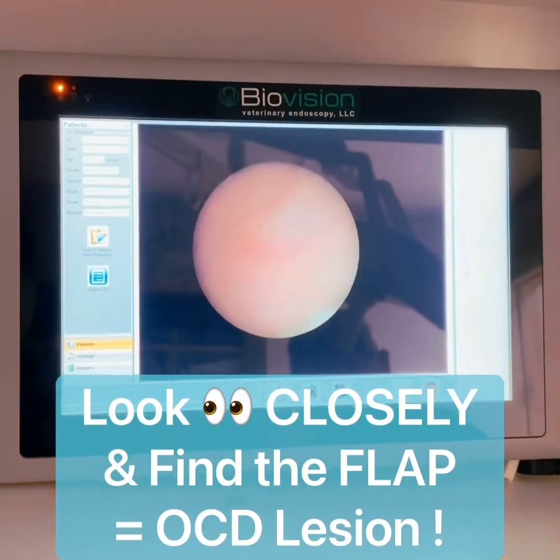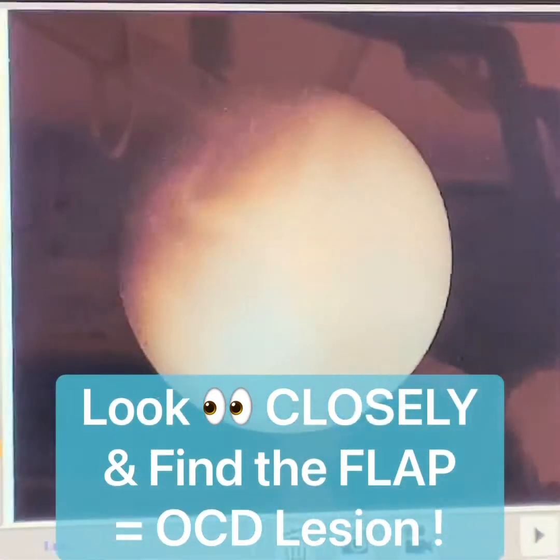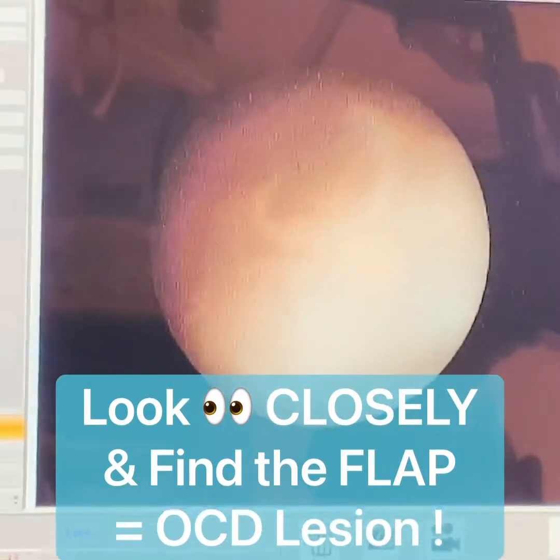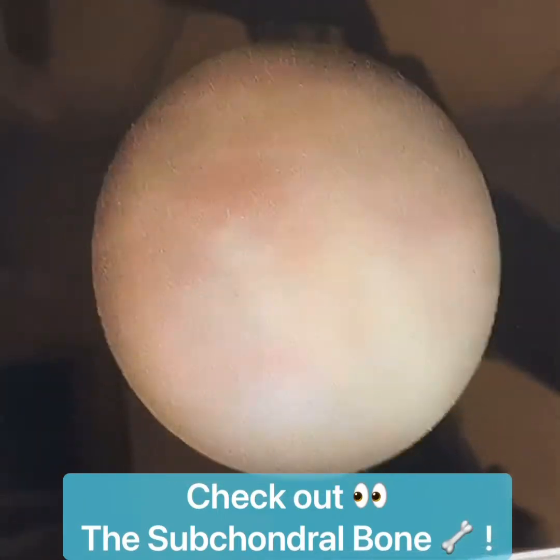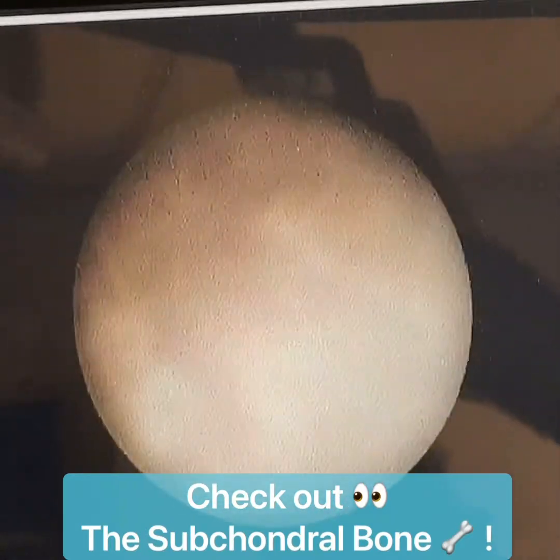Here we have the OCD lesion visible in front of us. It's been confirmed. We're going to go in and take that out. See down here at the bottom — there's a little reddened area. That is the subchondral bone where the articular cartilage is damaged.